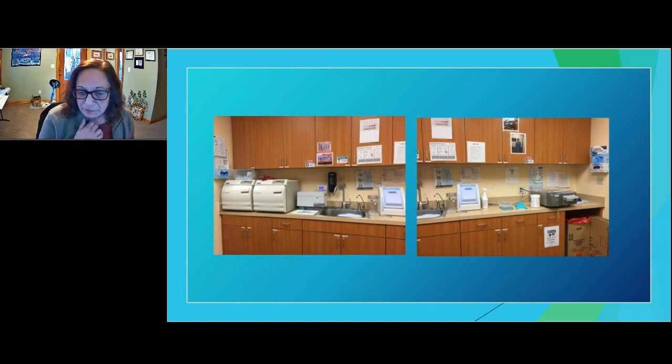This is an example from another facility I went to. This is actually all one room. I just didn't do a panoramic, so bear with me. So you'd walk in, on this picture, from your right-hand side. You'd walk past this sterilizer, past this handpiece cleaner, to the dirty sink. Then on the opposite side was the ultrasonic, right next to the two sterilizers, and then storage was on the opposite side.